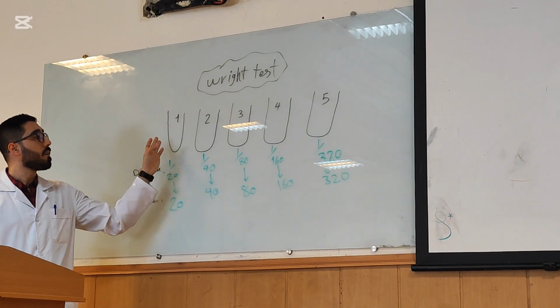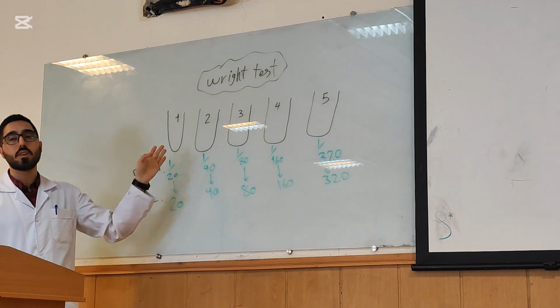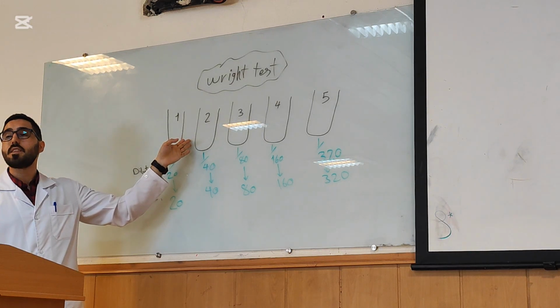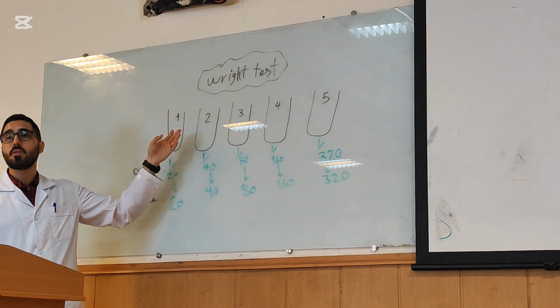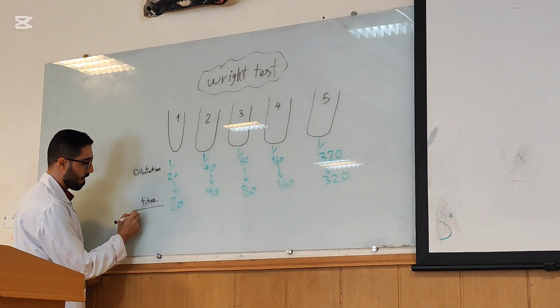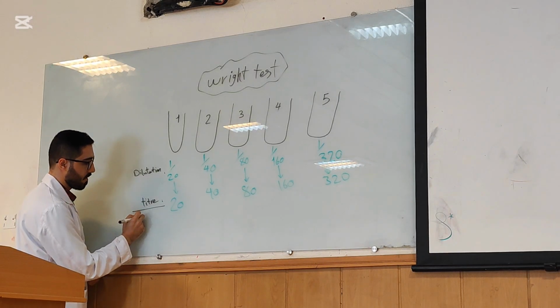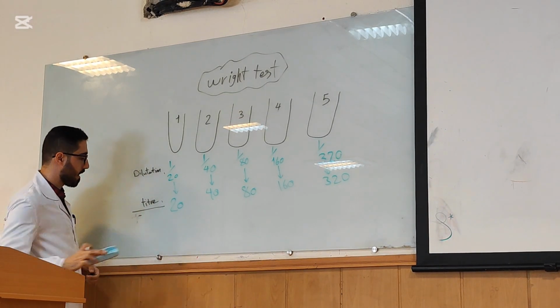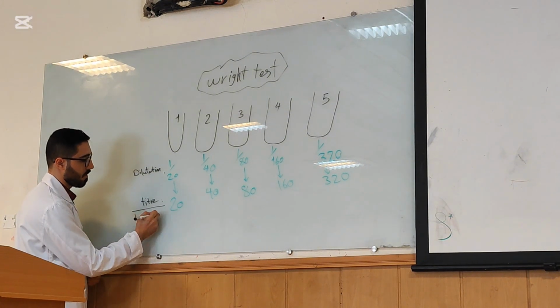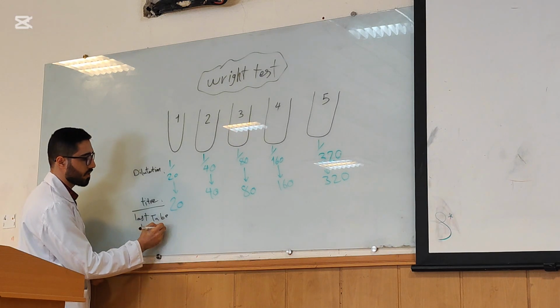You must report the titer of the test, which is the last tube with agglutination. Okay? Your last tube has agglutination.